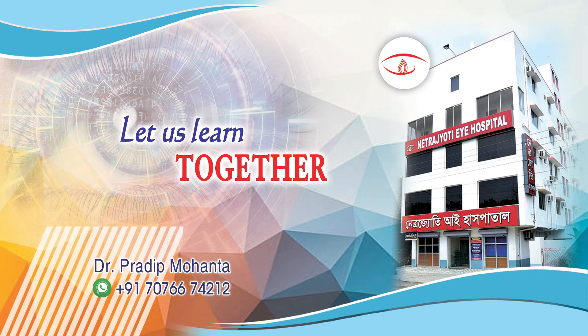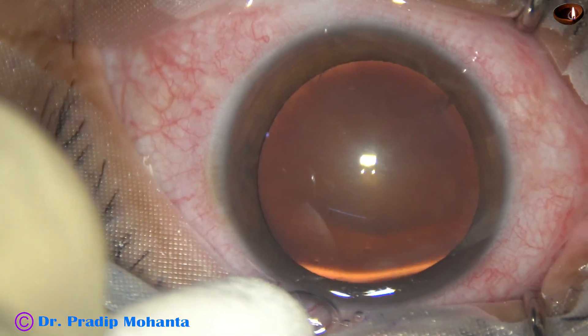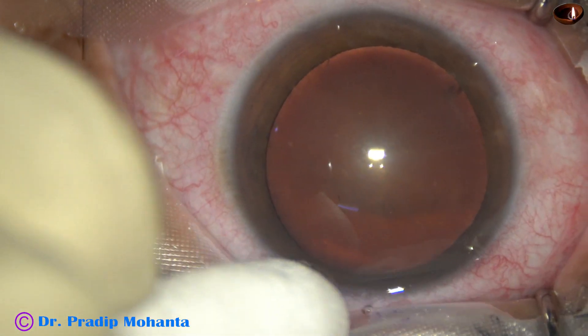Friends, welcome to my workplace at Rana Ghat, West Bengal, India. This is a soft cataract. Let us see the management of this case.